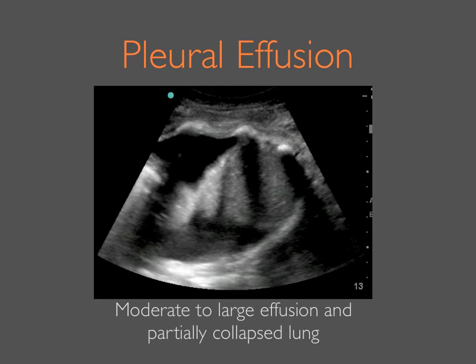Finally, be cautious when trying to quantify the volume of fluid. The thoracic space is large and irregular, which makes accurate statements about volume very difficult to make. Also, remember that the thorax is voluminous and has a large surface area. Therefore, a small effusion or a small amount of fluid may be difficult to locate without a thorough exam.